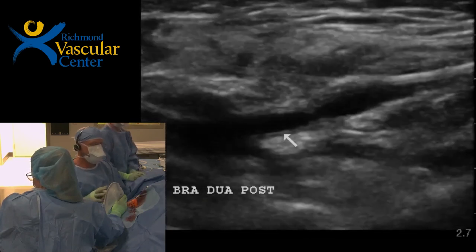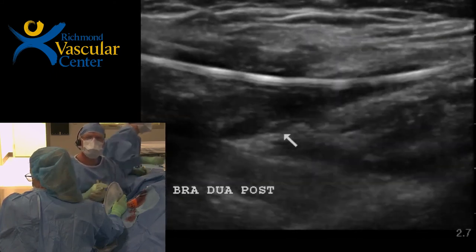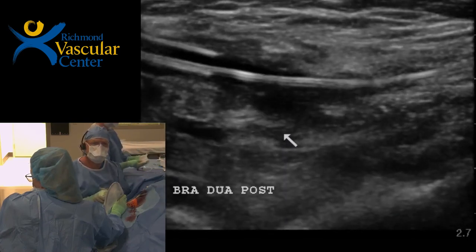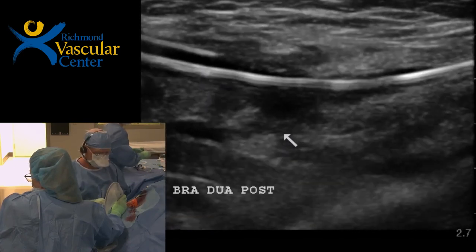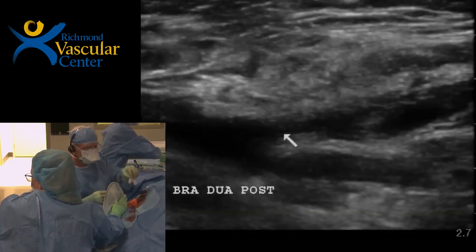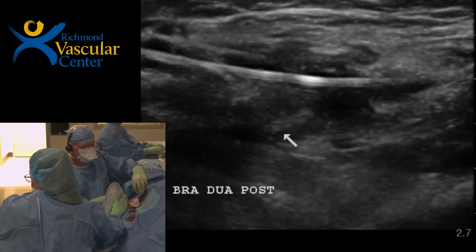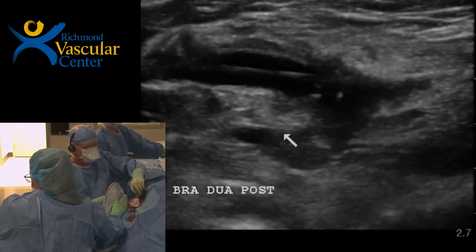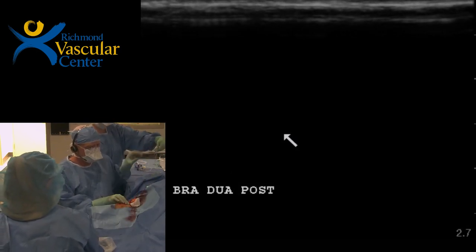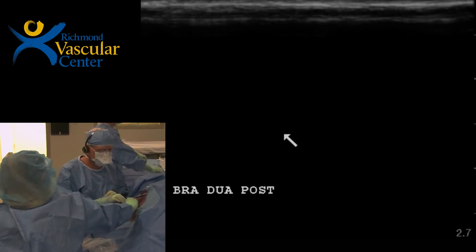All right, but those are things to think about. If I still wasn't happy with the flow, I might put a 4 millimeter balloon in there. Generally, when I come back at 4 weeks, if I'm trying to increase the flow, we'll use a 6 millimeter balloon. I will no longer use 7 and 8 because they will give you flows in the 2000. I'm pulling the sheath out, and we'll just hold light pressure here for 5 minutes.